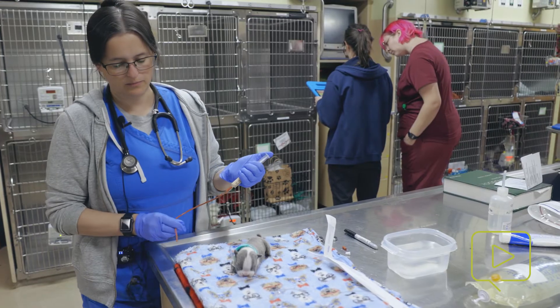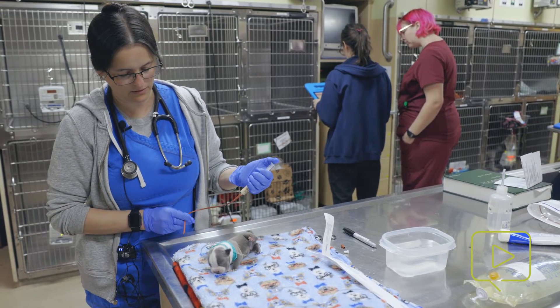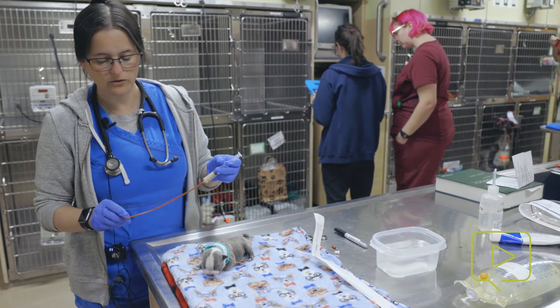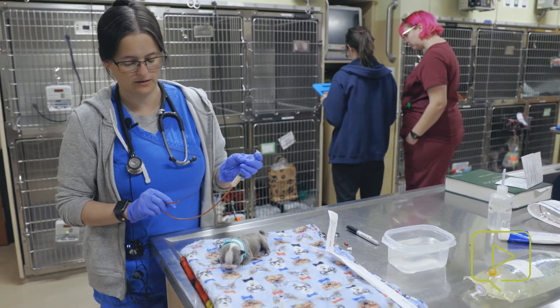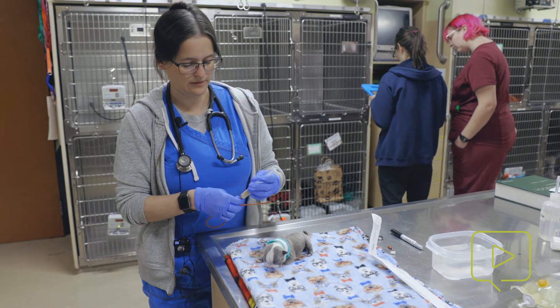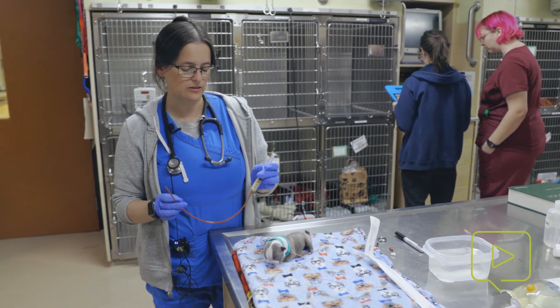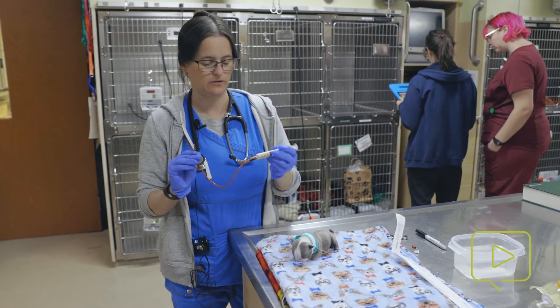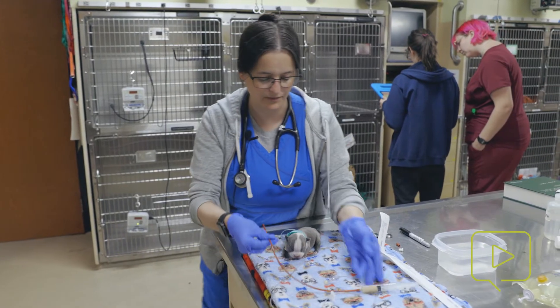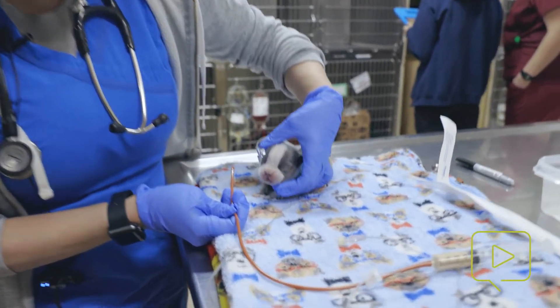You always want to make sure that your tube is patent. We've got a few little drips in there, but you don't want to flush any of the formula into the baby when you're placing the tube. Some people like to leave the syringe on when they're placing the tube; others like to take it off. I leave it on. You want to kind of angle towards the left side of their body.